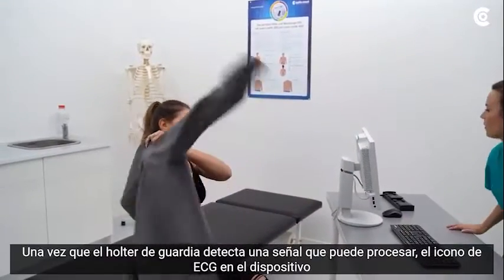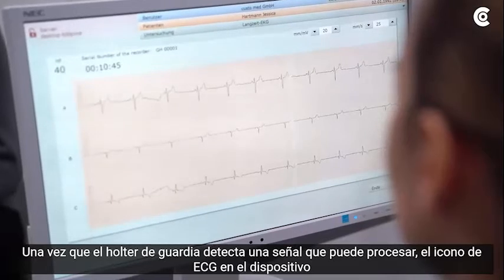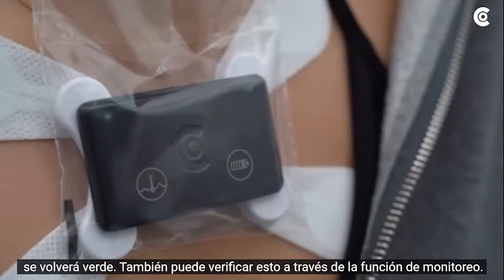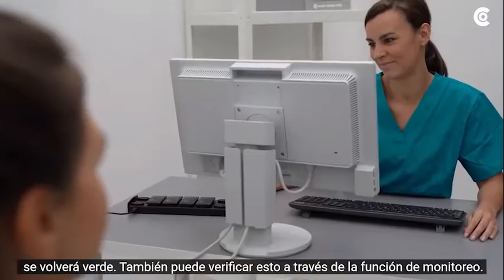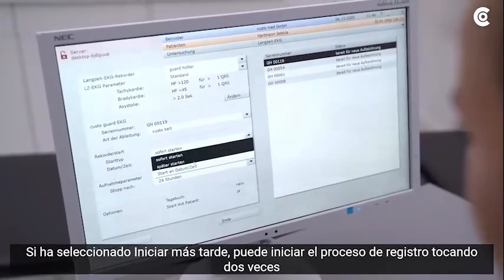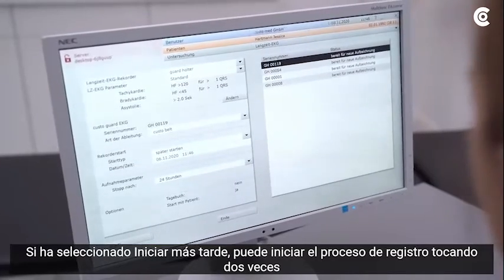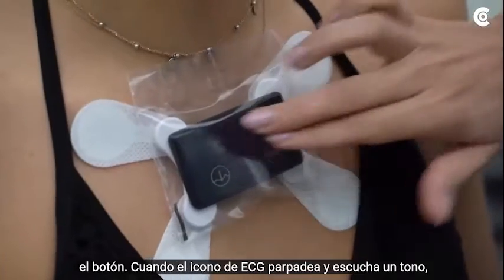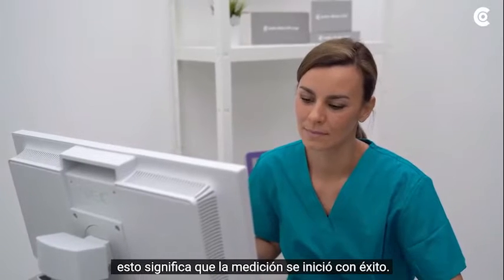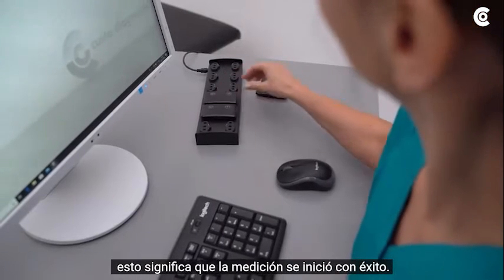Once the Guard Holter detects a signal it can process, the ECG icon on the device will turn green. You can also check this via the monitoring function. If you have selected Start Later, you can start the logging process by double-tapping the button. When the ECG icon flashes and you hear a tone, this means that the measurement was started successfully.